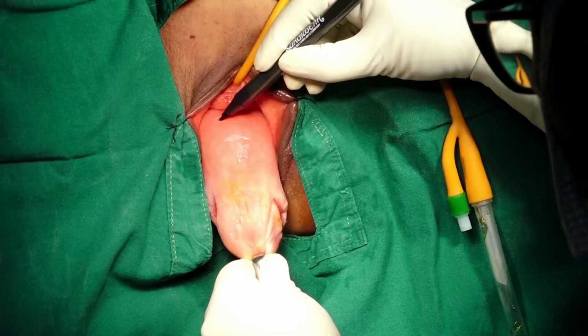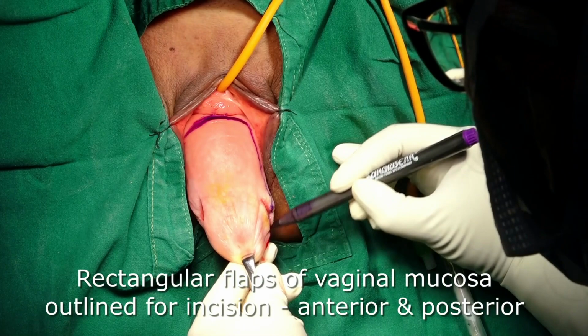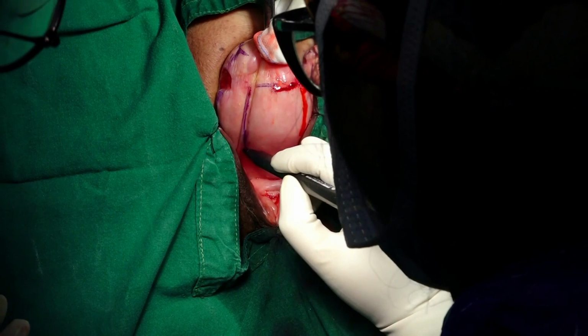Two rectangular sections of vaginal mucosa, one anteriorly and one posteriorly, are outlined for dissection. Anteriorly, the rectangular section is marked 4 cm below the urethra and 2 cm above the cervix. Posteriorly, the rectangular section is marked 2 cm below the cervix and 4 cm above the hymenal ring.